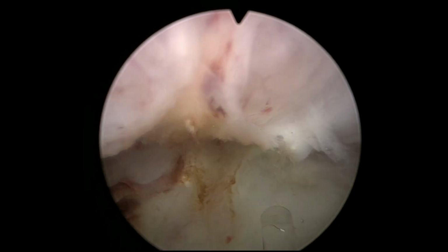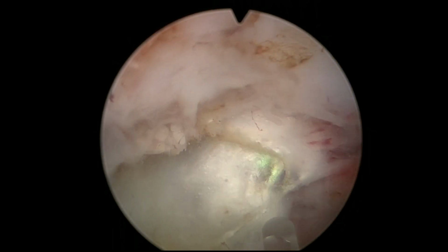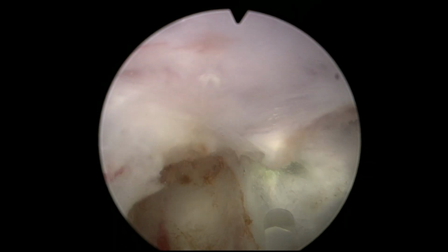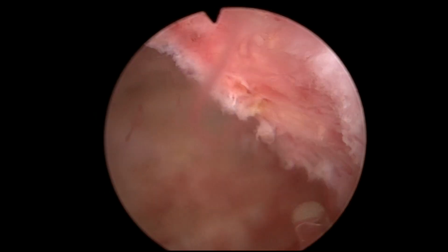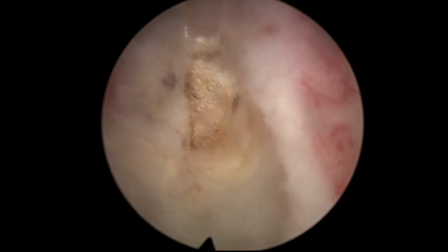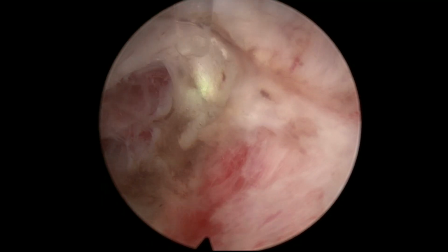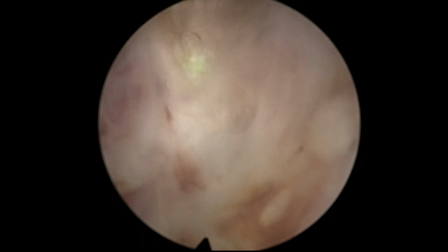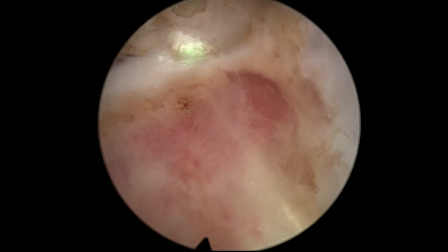But as I said, I see a lot of surgeons who are very happy and who defend their wavelength wholeheartedly. And I'm very curious to see how important the differences between different wavelengths and laser devices are, and to what extent can we compensate. For example, this laser, as I said, doesn't have the peak power that holmium has, but it has very good cutting properties, very good coagulation properties. So will the surgeon be able to compensate for the differences?